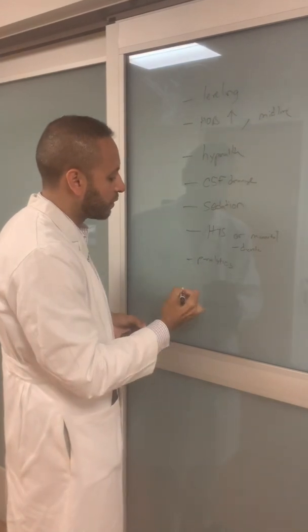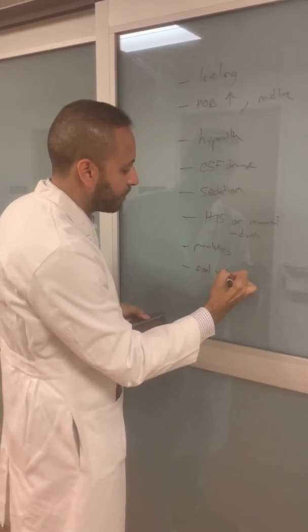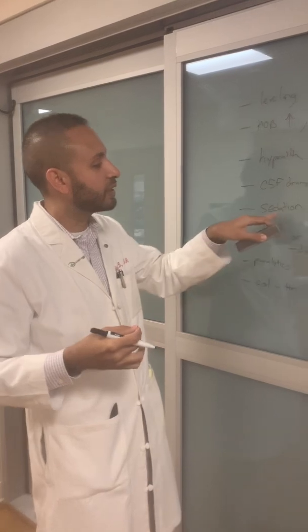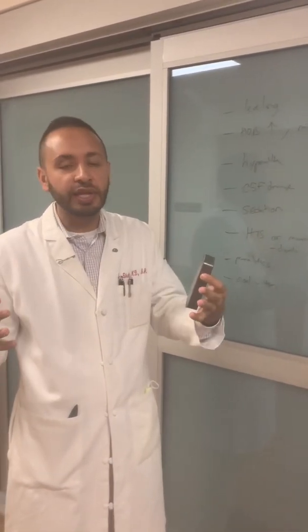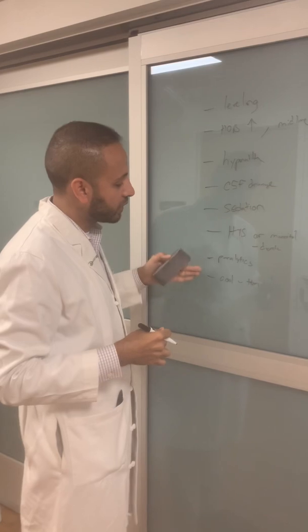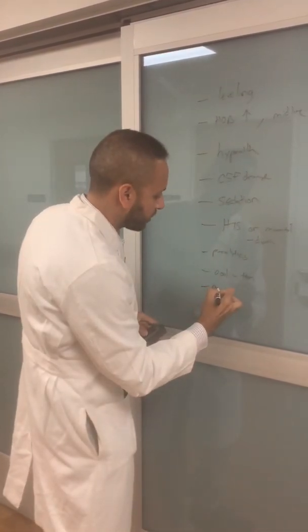Sometimes paralytics don't work. You can cool the patient. TTM. Again, what is TTM doing? Well, when you're cooling the brain down, you're turning the brain off. You're doing the same thing like sedation, but even more so, right? You're telling the brain, hey, listen, you don't need that much blood flow. Just turn off. After that, what happens? ICP comes down.